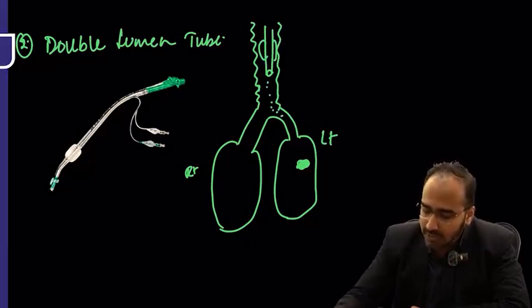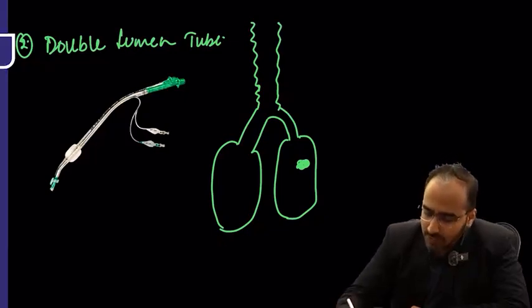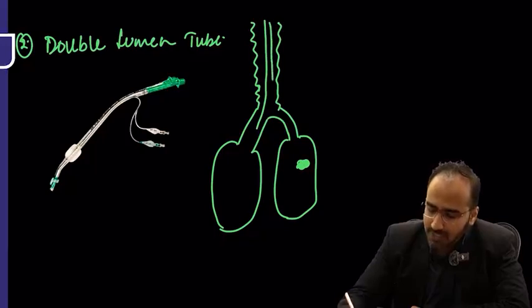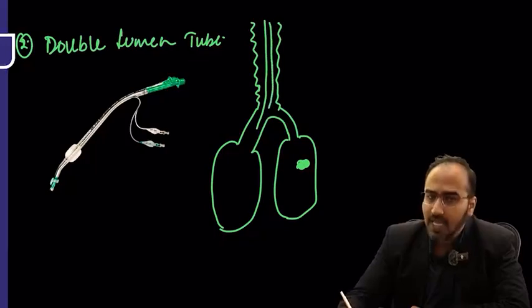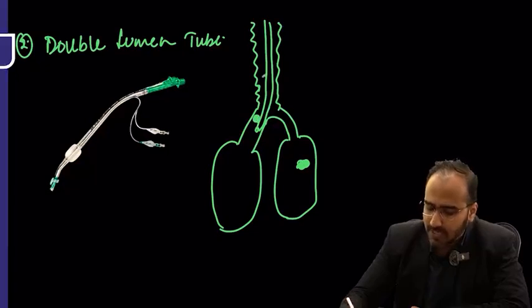I don't want this tube. For this surgery, I want a tube that is basically ventilating only one lung. So the tube that is used for one lung ventilation is a long tube called a double lumen tube, where you take this endotracheal tube, advance into the trachea. Once you feel the resistance, you just rotate the tube into the side where you have to put it. Okay? One will be the bronchial lumen, other will be the tracheal lumen.